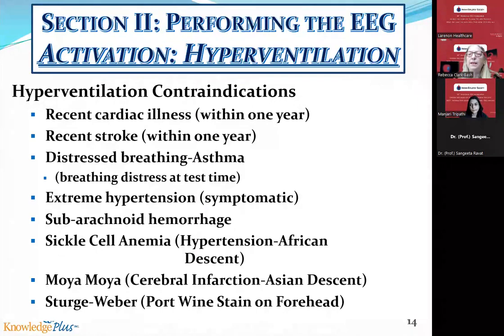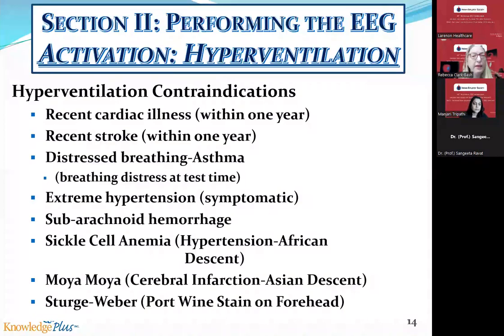Distressed breathing or asthma. Now, this is a contraindication. It is. But I want you to know that the only time we exclude an asthmatic, the only time we exclude somebody who has COPD is if they are having symptoms right now. If they have asthma, but they're not actively having an attack, they can do hyperventilation.